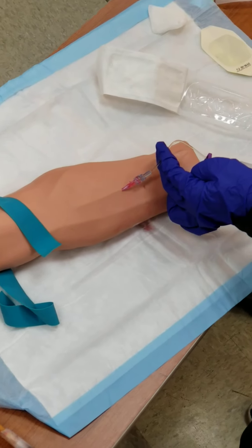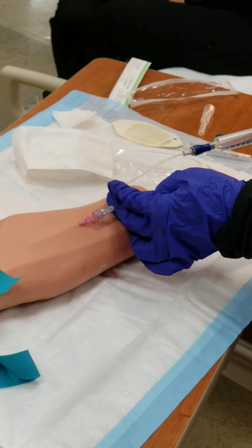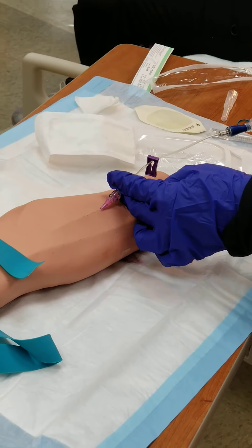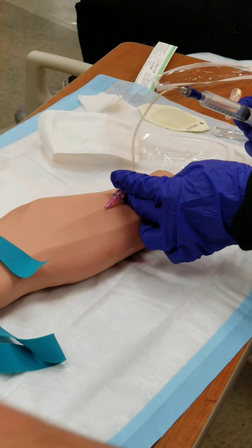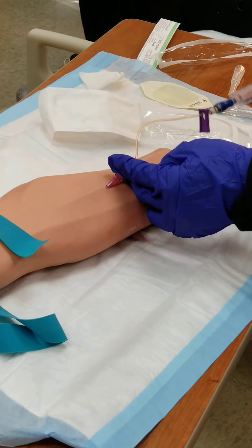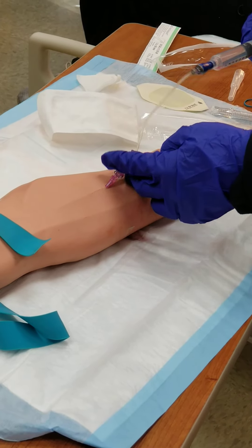We would rather have blood than air. So we hook it up. Now I want to push this through to make sure it's good — no pain, my patient feels okay. I'm pulling back. You may or may not get blood return. I closed it back up — you're going to open it back. See, it comes through? And then you can just flush it over — I'm just showing you guys.